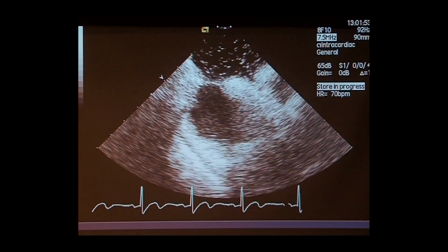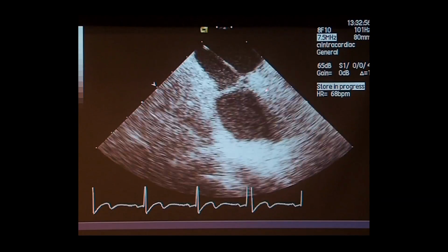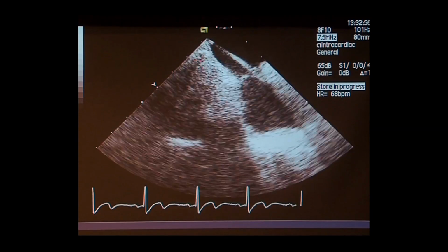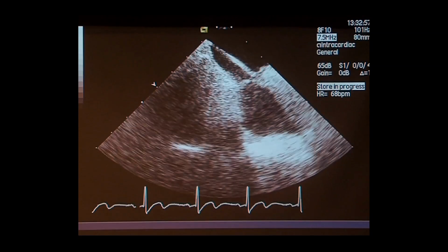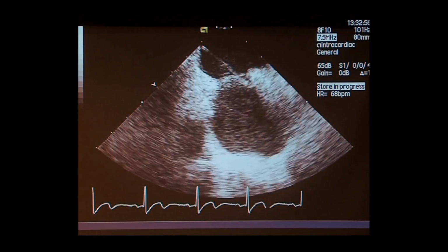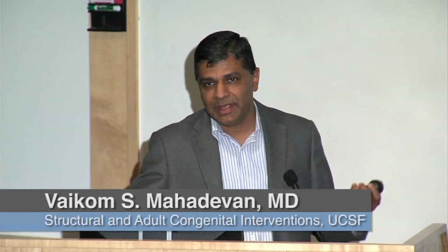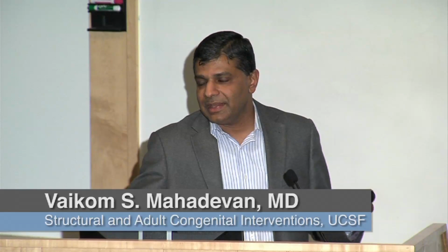So essentially what we do is, we can go ahead and cross this hole with a wire. Can you see that? That wire is crossing across this hole. We've gone through a leg vein and crossed this hole. This is all done while the patient is awake, and actually they can see this live on the echo screen. Some of them prefer to, some of them don't. But if you really fancy it, you can see the whole closure procedure wide awake and looking at the echo screen, and exactly you can know what is going on.